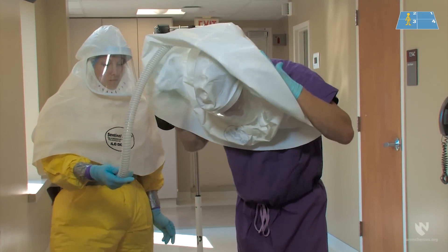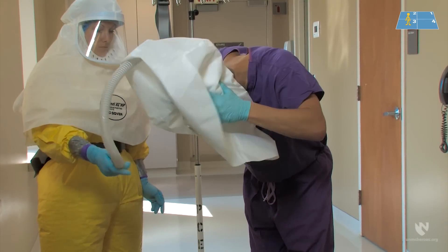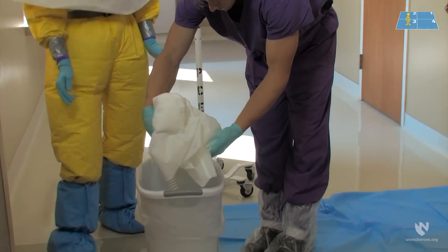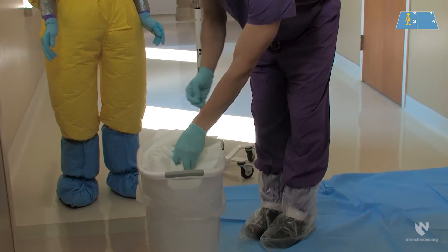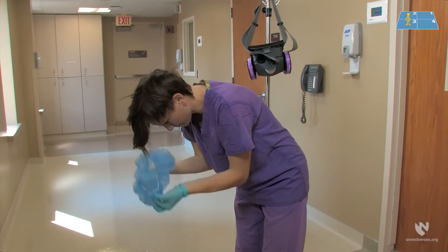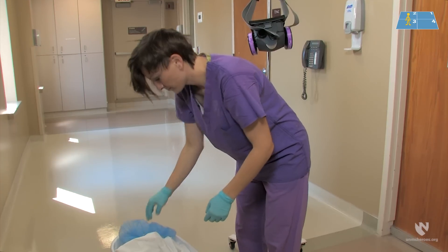The doffing partner should be careful not to allow the tubing to touch the scrubs or any exposed part of the healthcare worker being doffed. The hood is removed in a gentle up and forward motion, and all parts will be placed gently in the trash. If the healthcare worker is wearing a surgical cap, it should be removed next using a clean pair of gloves, with a gentle up and forward motion, and placed in the trash.